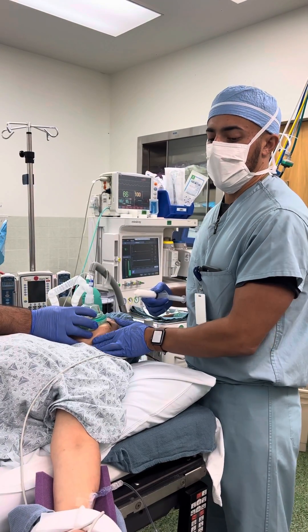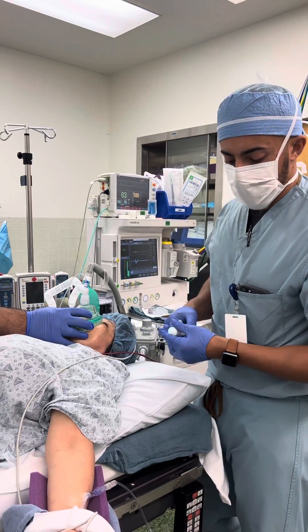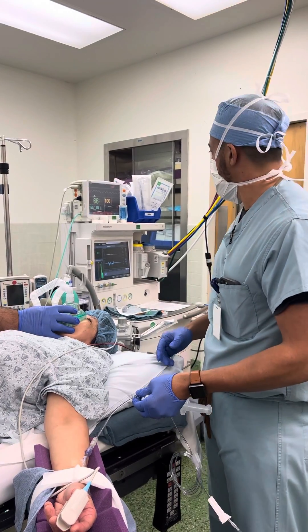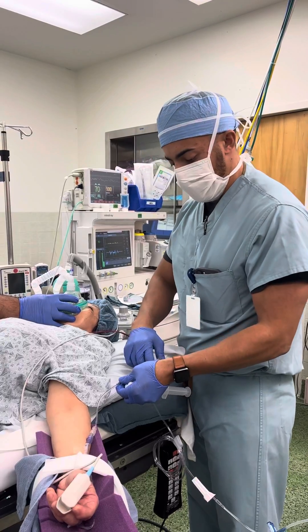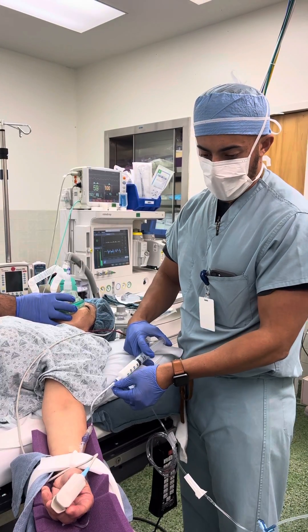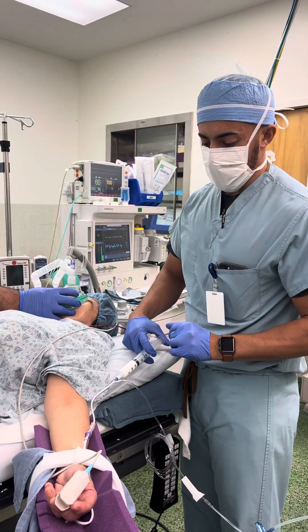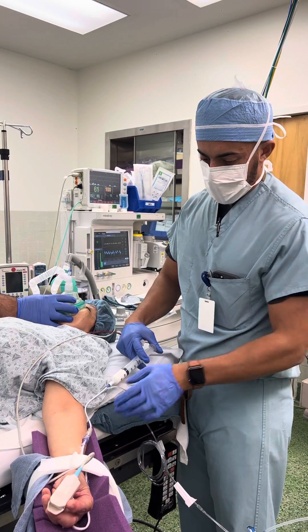Just had a little burst of fentanyl on board, and I'll induce here with Propofol. Just a little light on the blood pressure — she was a little nervous when she came in, that's why the pressure was a little bit high. Got a little lidocaine here to help with the burning, and then here comes some Propofol. My intuition tells me she's a little bit light, so I'm not going to give her a full dose of what I usually give other people. But let's see how she does here.